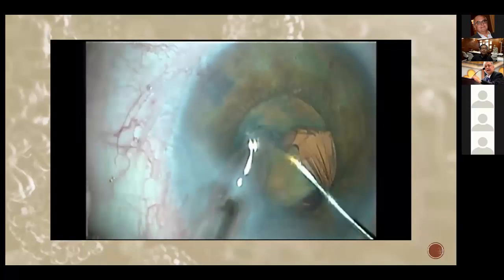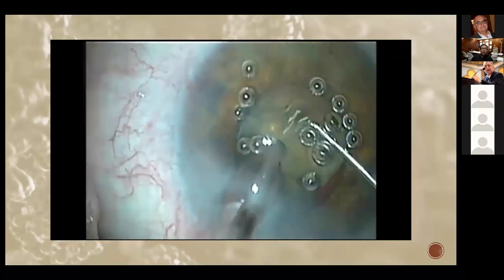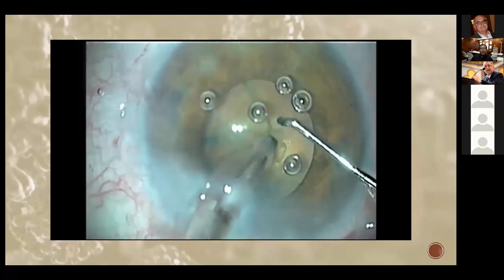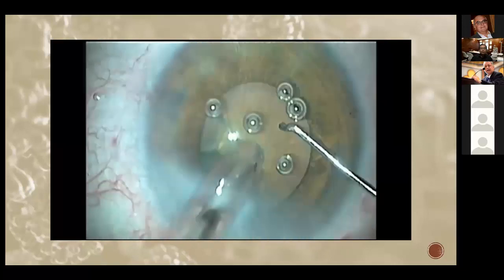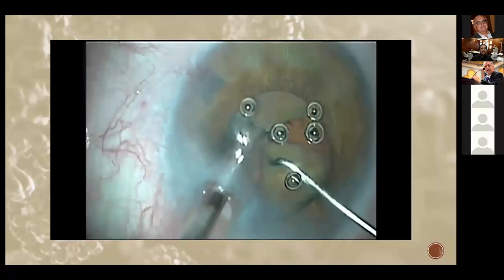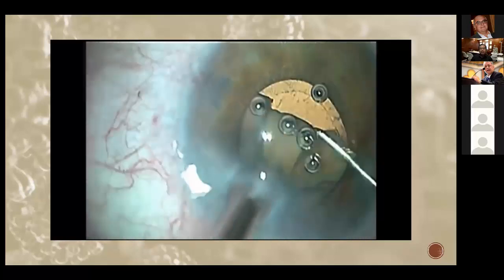I don't start phacoemulsifying the nucleus fragments that I chop. I chop all the quadrants. I keep chopping, protecting my posterior capsule, until I manage to chop the whole nucleus into small pieces. And then I start emulsifying it. In this way, I maintain the posterior capsule away from my phacotip all the time.